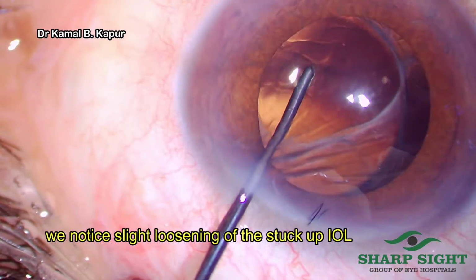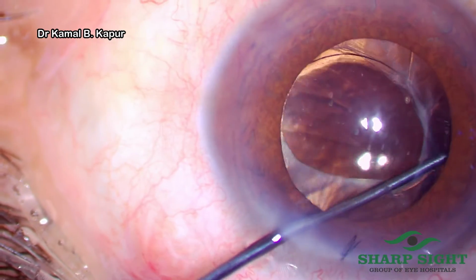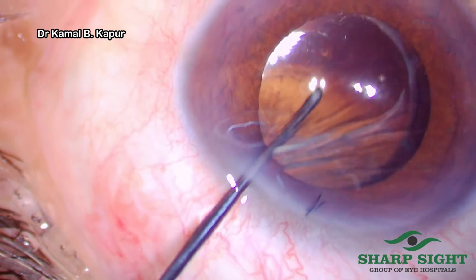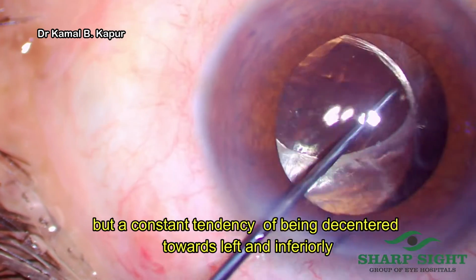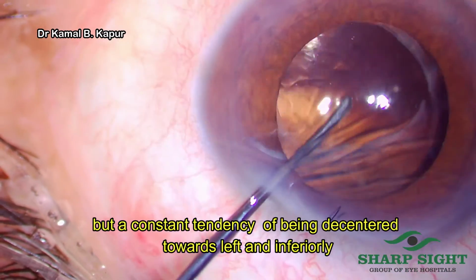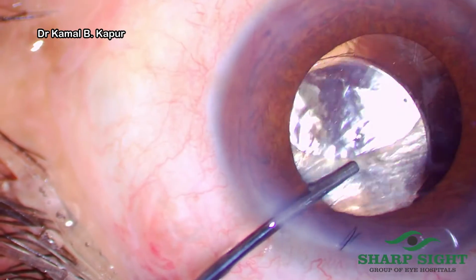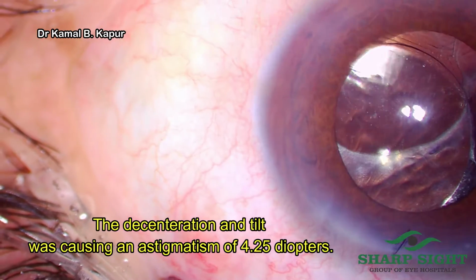posterior capsule. We realize that this maneuver has slightly loosened up the lens for us, but still is not achieving what we want. We try and push and nudge the lens back in place, but there are a lot of adhesions between the anterior and posterior capsule, especially on the right and upper part of your video, which are not letting the lens move back to its place.